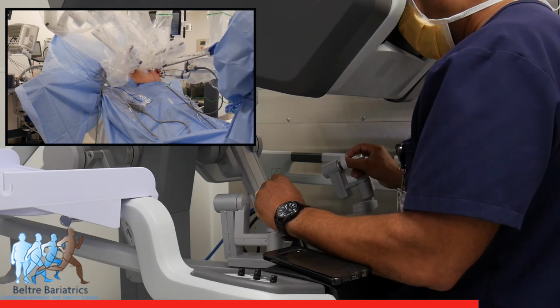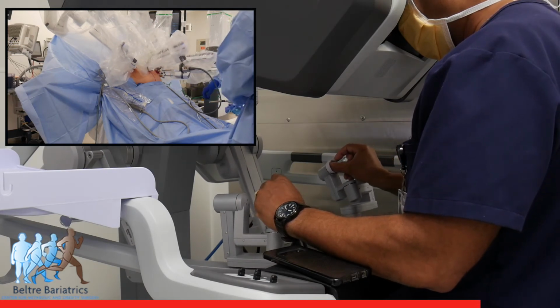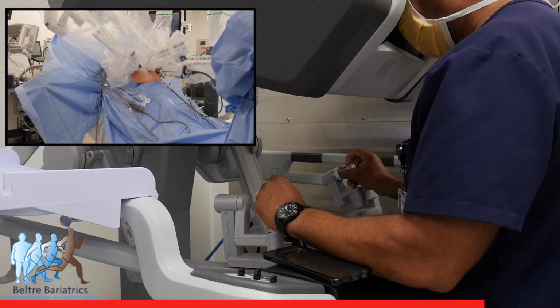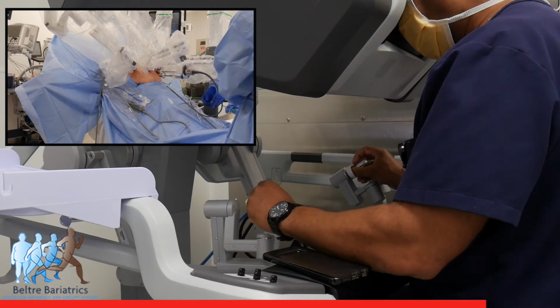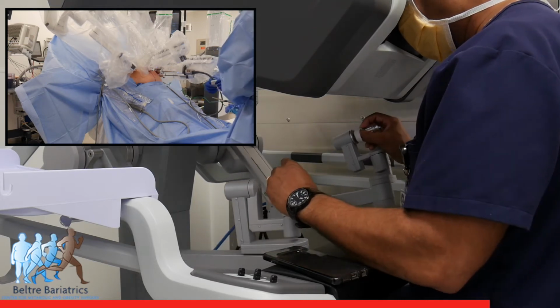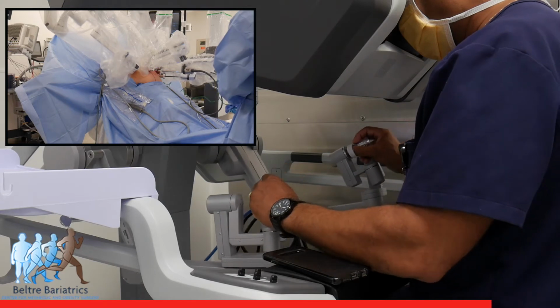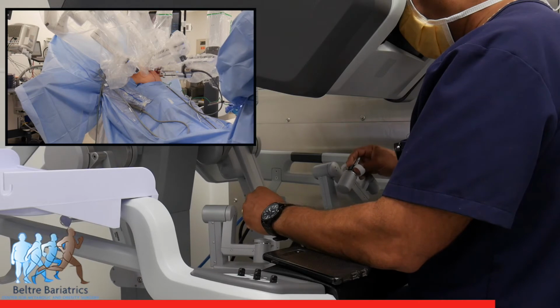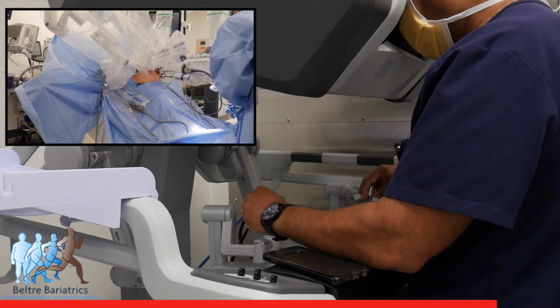Ahí me pueden ver cómo estoy controlando. Ahí estoy operando ya. Estoy controlando los movimientos del robot. Como pueden observar en la pantalla arriba, cada movimiento que yo hago, uno de las manos o el brazo del robot se mueve con mucha precisión en sí. Así yo puedo suturar, puedo hacer cualquier movimiento que uno normalmente hace durante la cirugía.